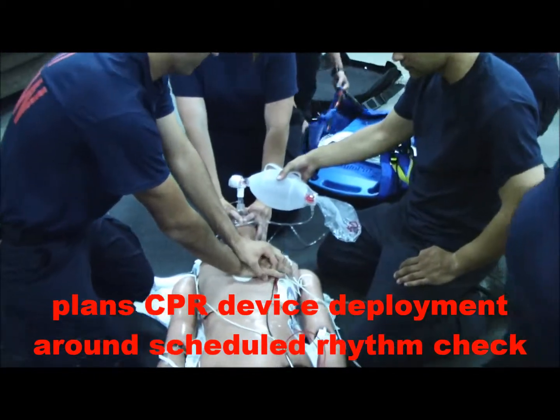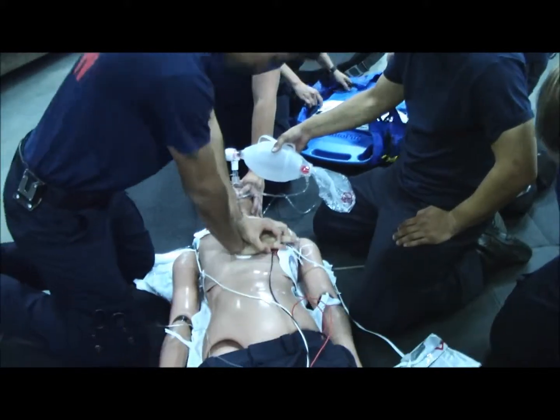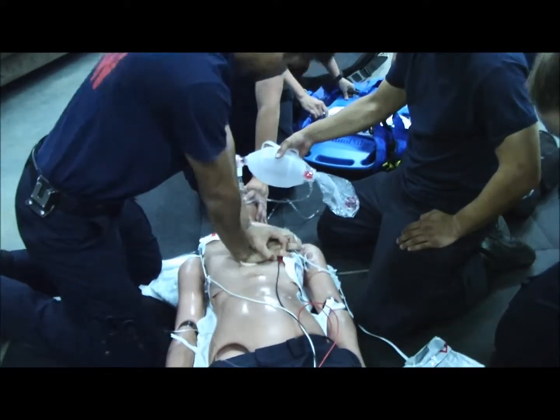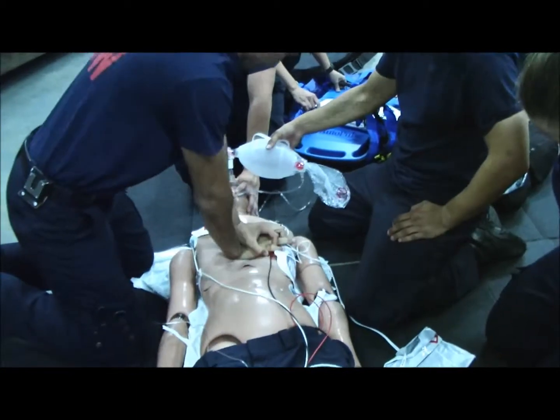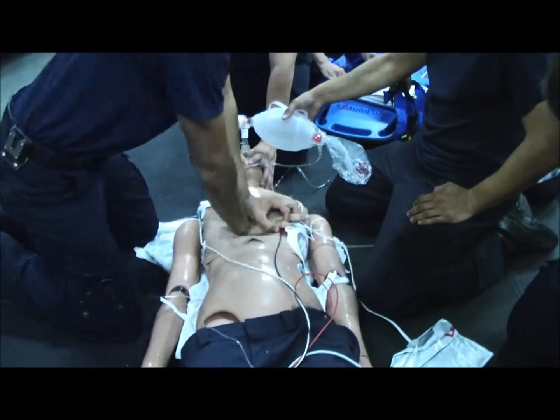After this one we'll go ahead and analyze rhythm, have them switch out. 3, 4, 5, 6, 7, 8, 9, 10, 11, 12, 14, 15, 16, 17, 18, 19, 20, 22, 23, 24, 25, 26, 27, 28, 29, 30.